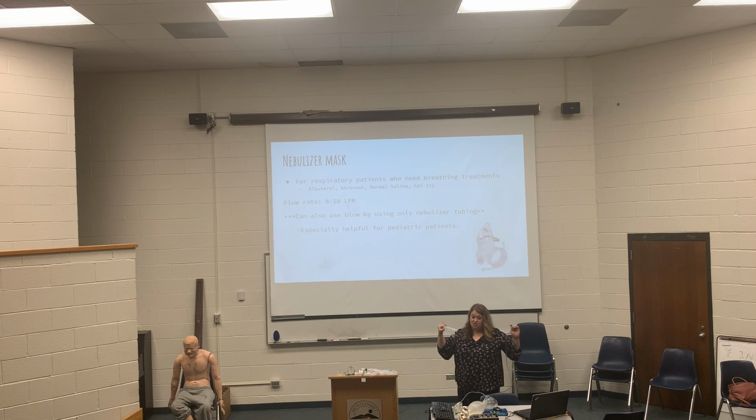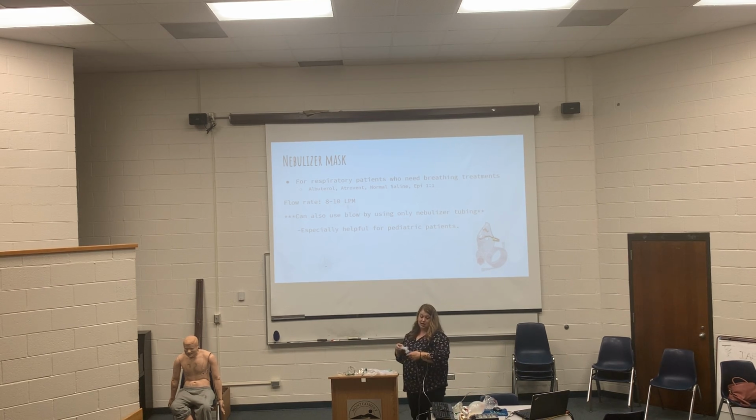So this is hooked up to the oxygen, and so all of that nebulized medicine is coming out from right here. It's not coming out this side too. And you can just hold it by the baby, and if they're crying, you know that they're gonna be gasping, and so they will be getting that medicine. And mom can hold it.